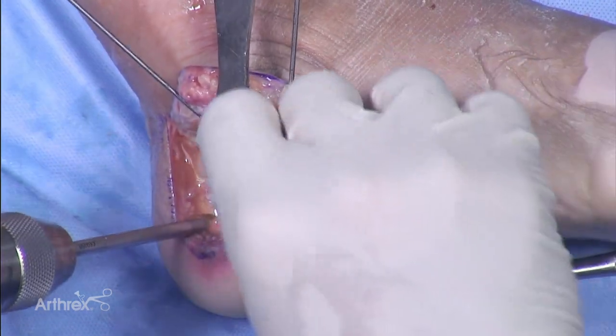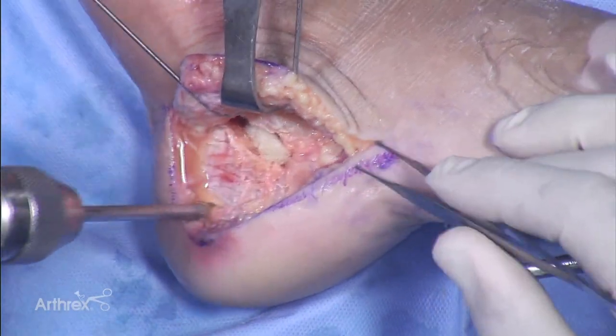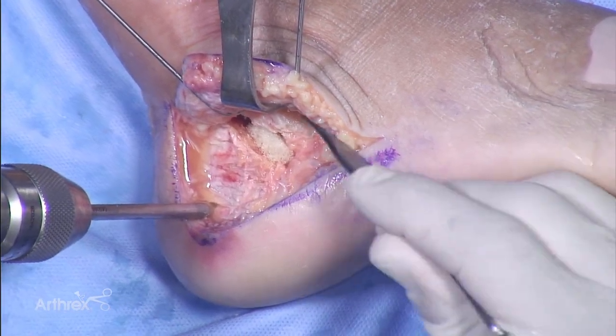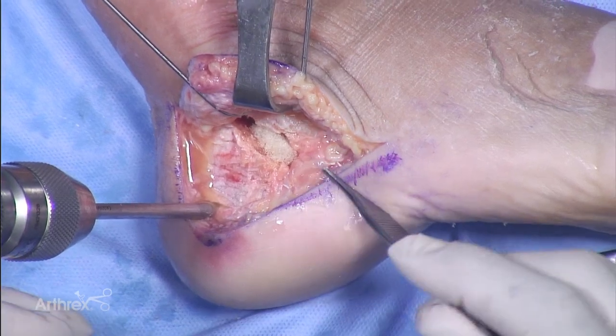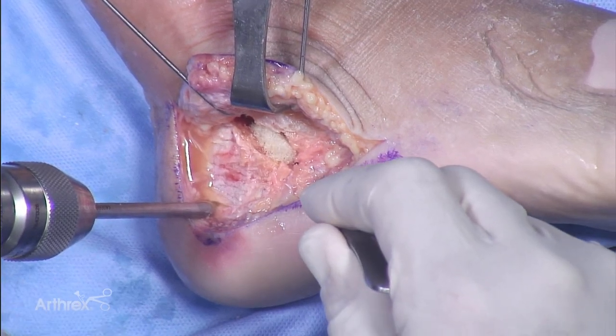To demonstrate — if I set this in, you can see it wedges in and completely holds that area. So if I had that in a sub-articular area it would hold my sub-articular deficit reduced, and I could place my calcaneal plate over it. I do not have any K-wires or other fixation getting in the way of my definitive plate fixation.